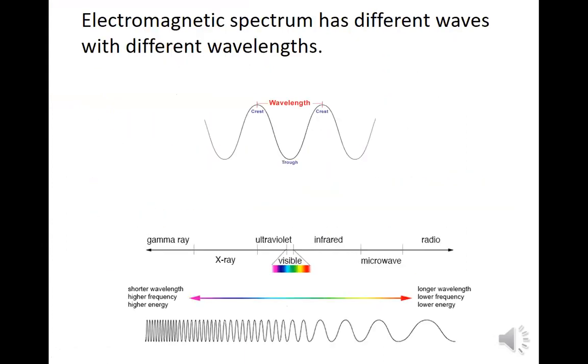Right, so we're going to look at two different wavelengths. Pulse oximeter is going to use two different wavelengths. One is infrared, and infrared is about 920 nanometers. So oxyhemoglobin absorbs infrared light. So the more infrared light that's absorbed in that hemoglobin sample, the more oxyhemoglobin is in that sample.